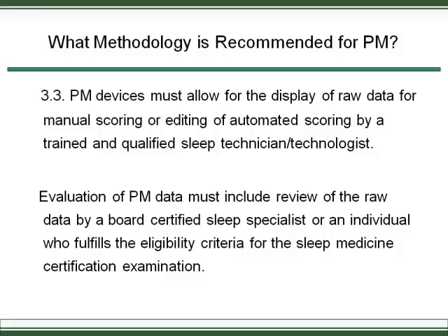I saw the other day a study that came to me where every apnea was obstructive, and I looked at them and I kept rubbing my eyes and I was saying, where is the effort? And it turns out this person had Cheyne-Stokes breathing with lots of central apnea. So the technologist said, well, that must have gotten by me. And I said, well, it happens. So the idea is the more eyes looking at a study, the less chance there is of missing something. As you know, the reimbursement for these studies isn't great. And so it's important when you choose a device that the automated scoring is pretty good. But again, the automated scoring won't be very good if the signals aren't good.